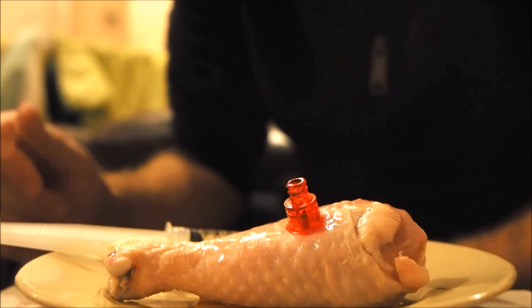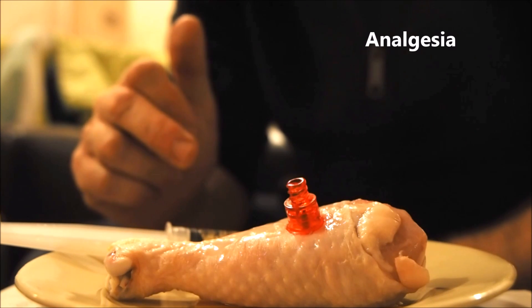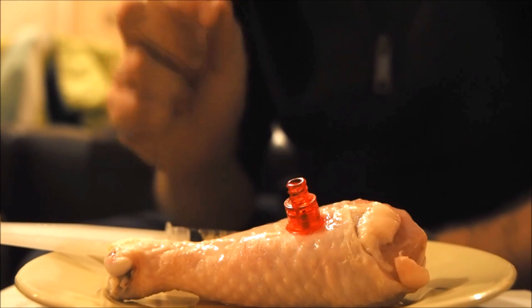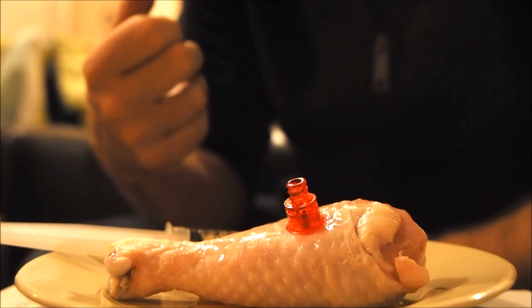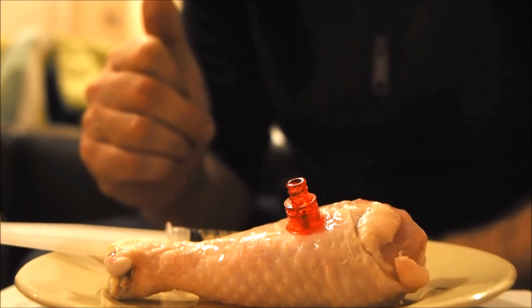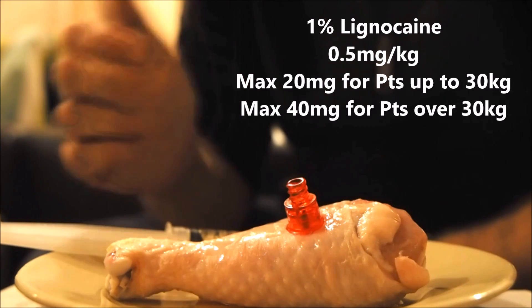I'm just going to interrupt myself here to make a couple of important points. Once you've put this thing in, you need to provide pain relief if your patient's conscious, and you need to provide a good flush. You might think that drilling into the bone hurts, but apparently not. What does hurt, however, is if you start ramming fluid through there — that creates pressure inside the bone, which is pretty uncomfortable. In Ambulance Victoria, we use 1% lignocaine at half a milligram per kilogram of the patient's weight, but you can look up your local guidelines.